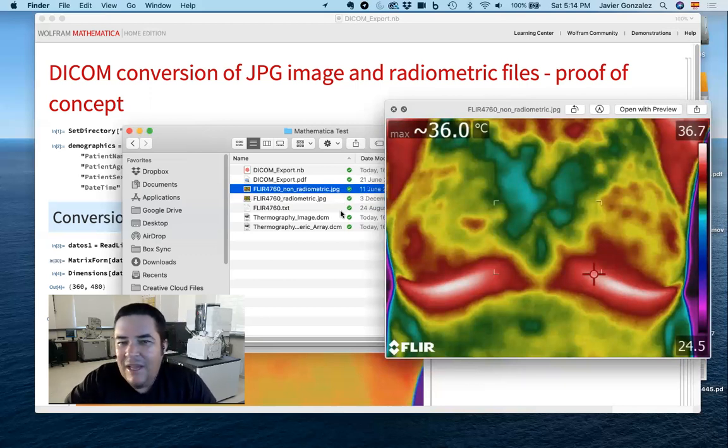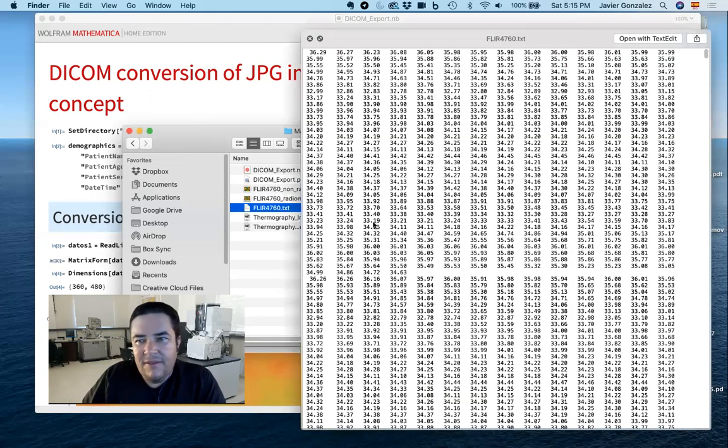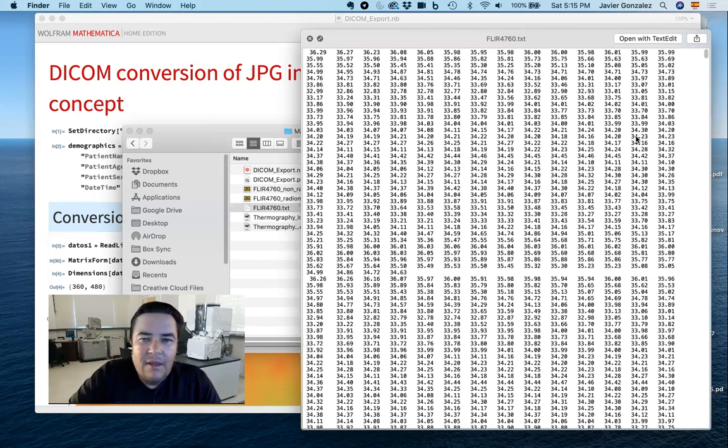So basically, you might think it's the same file. I mean, it looks exactly the same. So how come one is way larger than the other one? Well, that's because the radiometric file has the temperature matrix of every single pixel. So with the MATLAB software development kit, I can split that file into a text file with all the temperature values and an image file, which is basically a simple JPEG file.